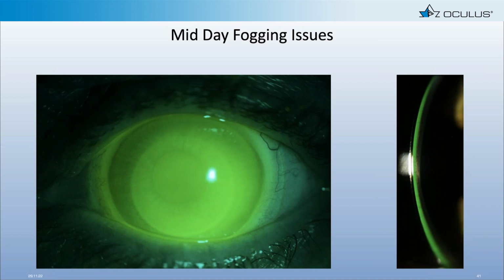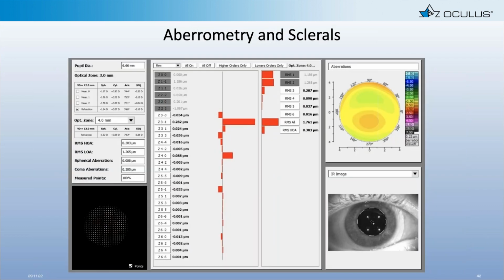So again, utilizing the software integration, it's very successful with initial lens design, especially if your map is good. If you get a good map, you're going to get a good initial lens. And the difference being now is that the softwares have become more user-friendly and much easier to make modifications with, so you can go ahead and adjust those fits and get them optimized over a very short time frame.